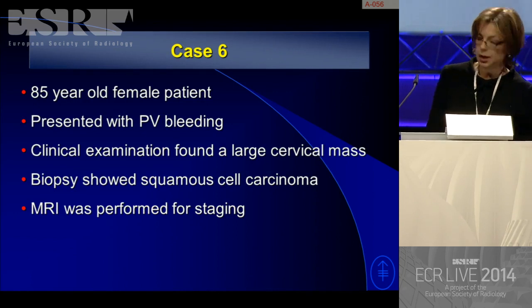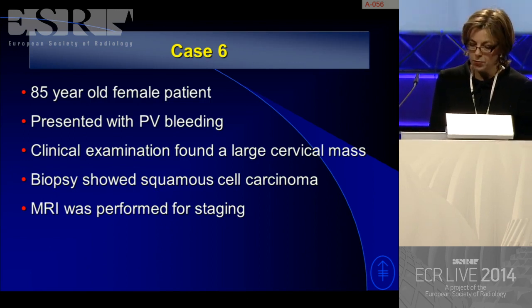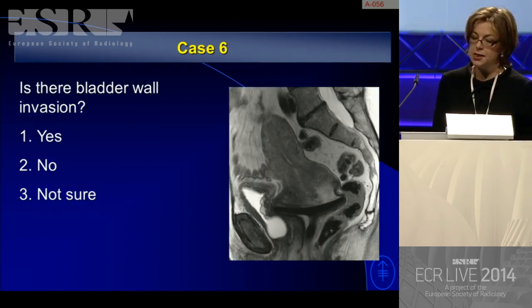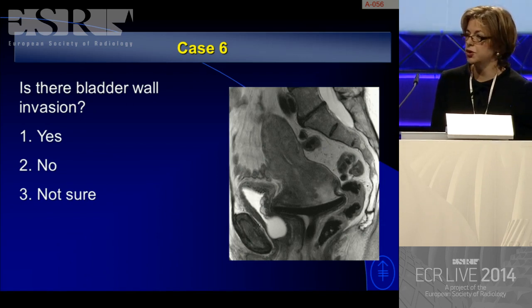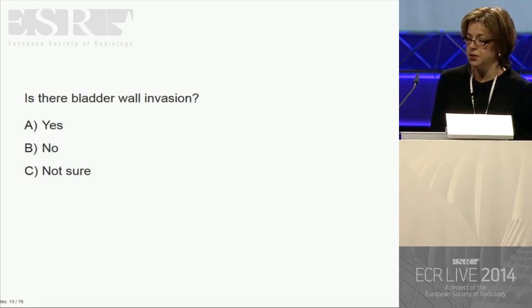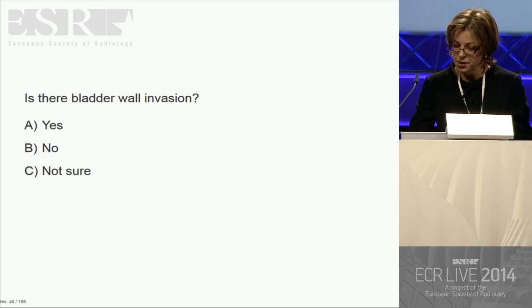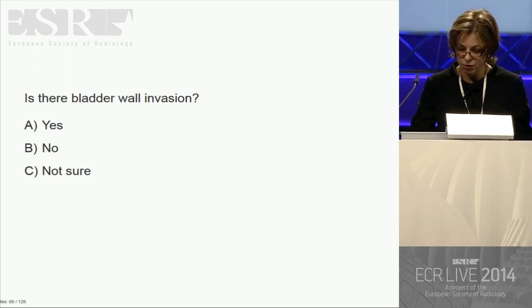Case six: an 85-year-old female presenting with vaginal bleeding. Clinical examination found a large cervical mass; biopsy shows squamous cell carcinoma of the cervix. MRI is performed for staging. The key question: is there bladder wall mucosal invasion? Mucosal invasion would be FIGO stage 4A. FIGO is a clinical staging system — stage 4A is based on cystoscopy.